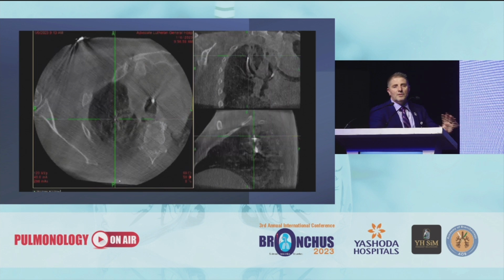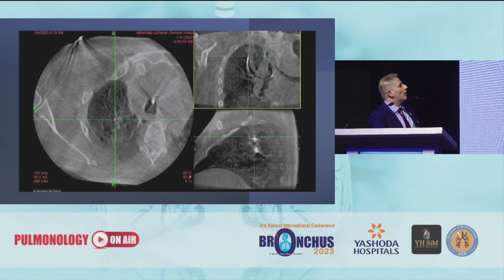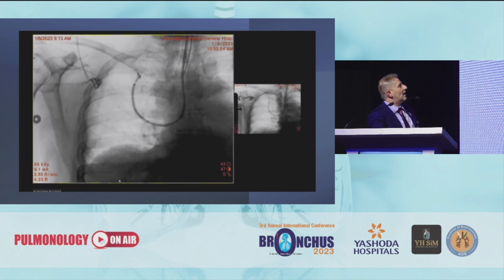Now we are ready with the coil inside the catheter. We spin and confirm that we reached the target after driving with the robot, as you saw earlier in the morning with multiple talks. When we reach the target and make sure that we are on it, we proceed by deploying the coil. You can see it's pushed through the catheter out of the robot, with the guide wire out, and the coil already sitting in the area where we want.